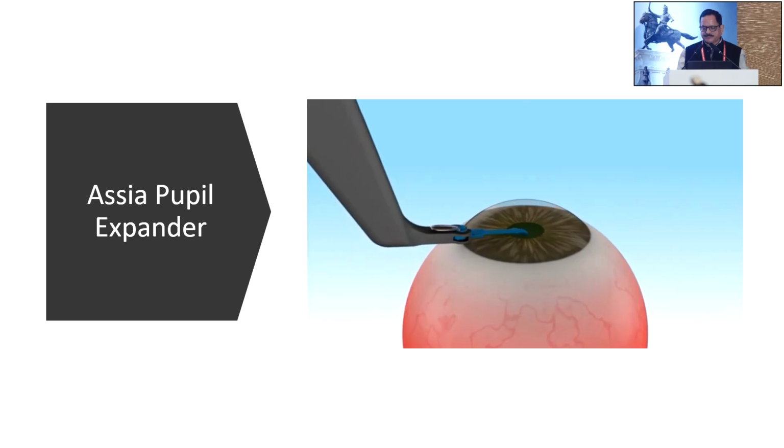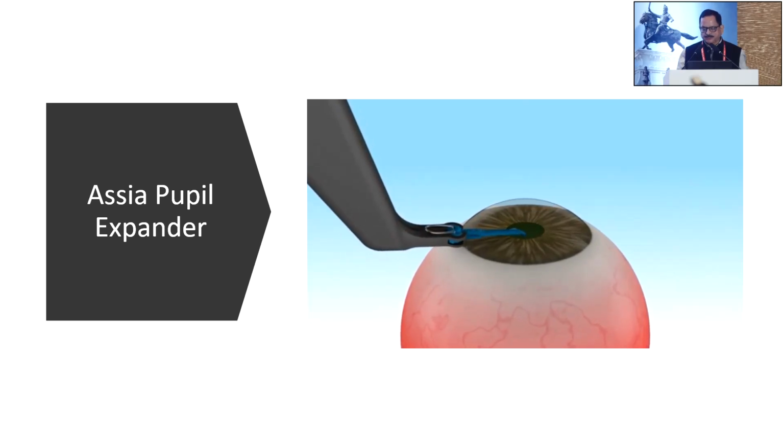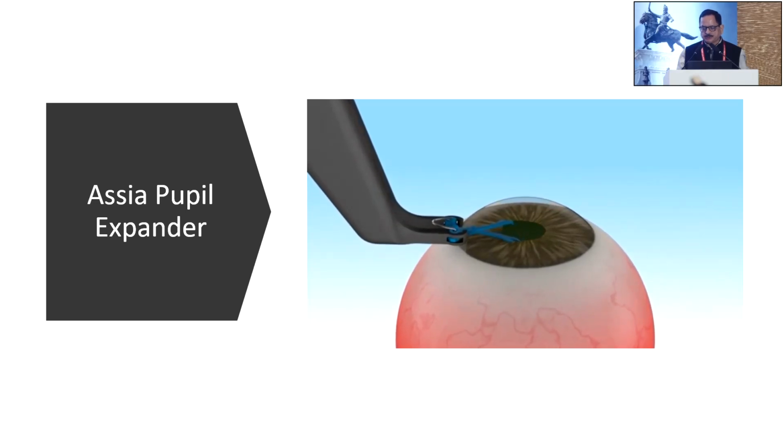The advantage here is you don't have to put a second instrument inside the eye. You're just directly putting your expansion device.